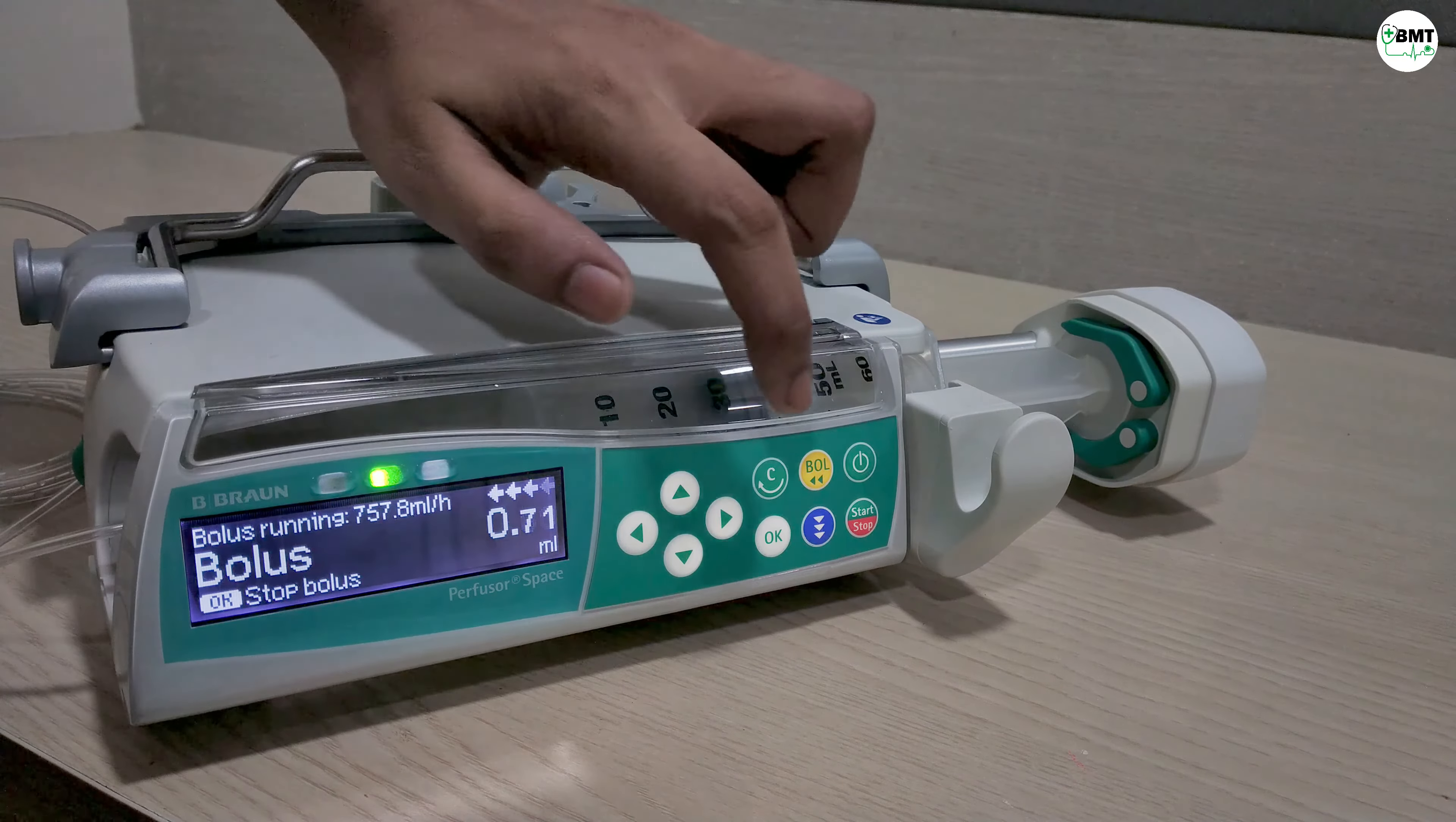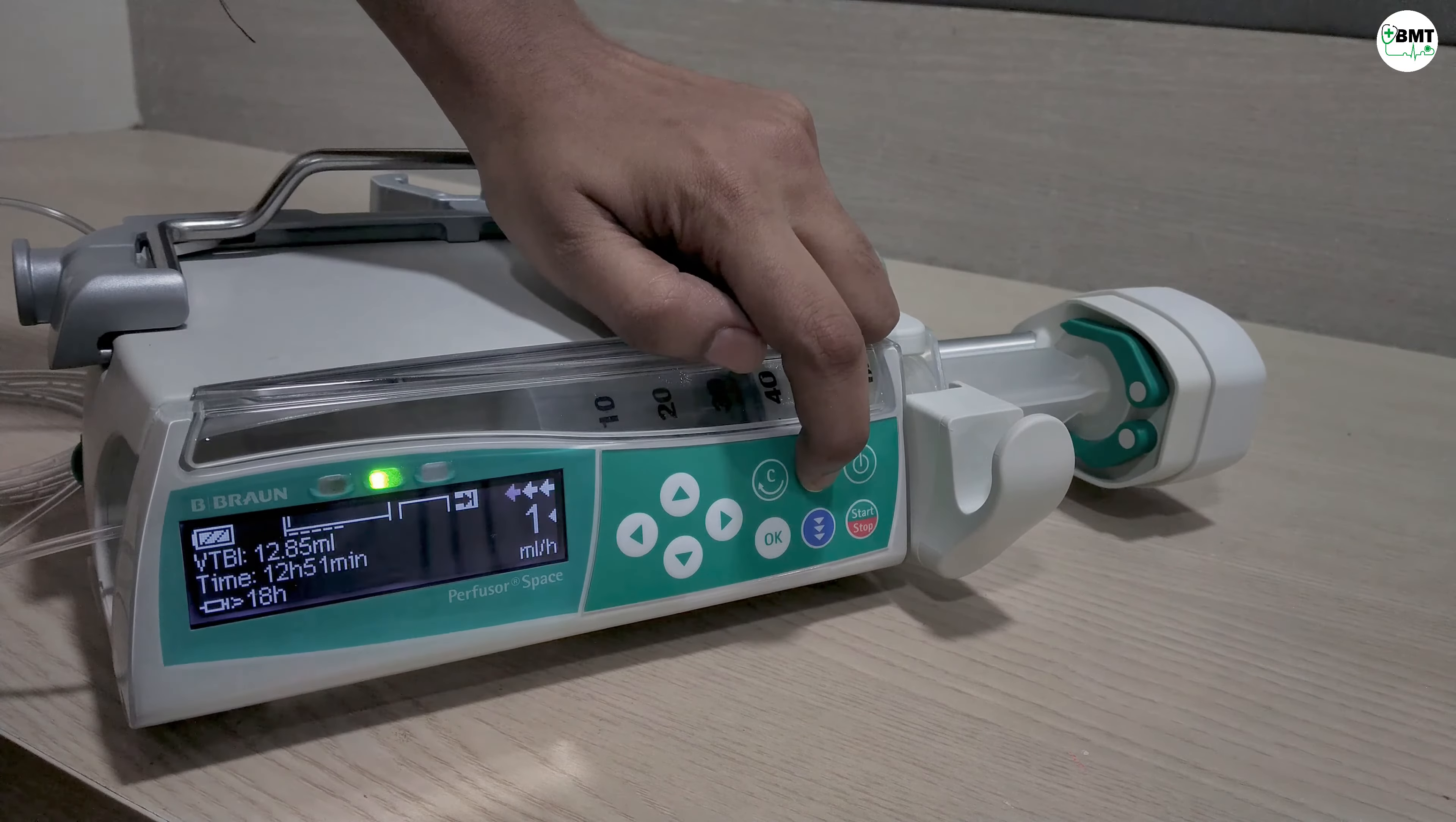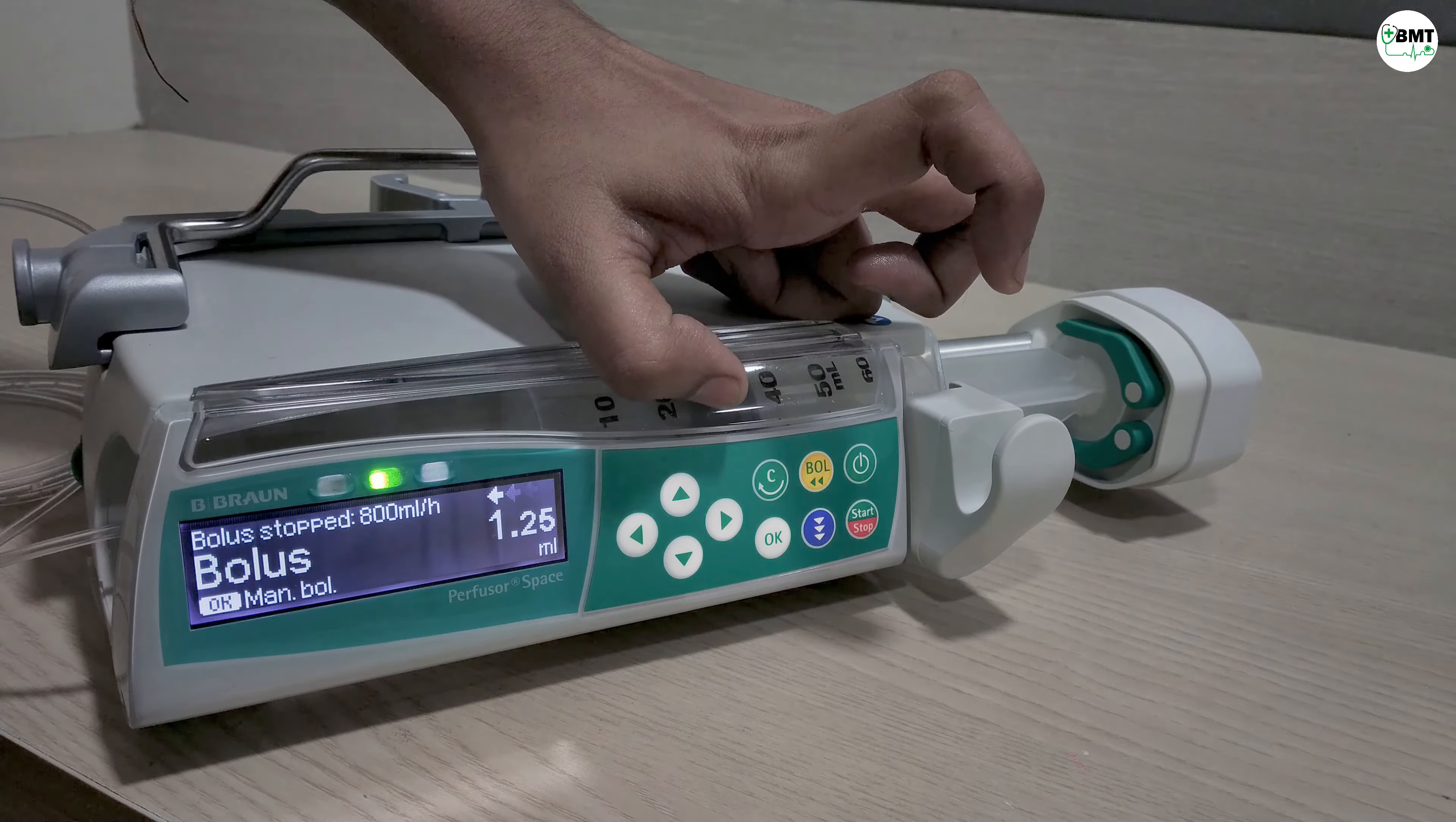Now to stop, press OK. If you want to give bolus manually, press on the bolus and then keep pressed OK button. Once done, stop.